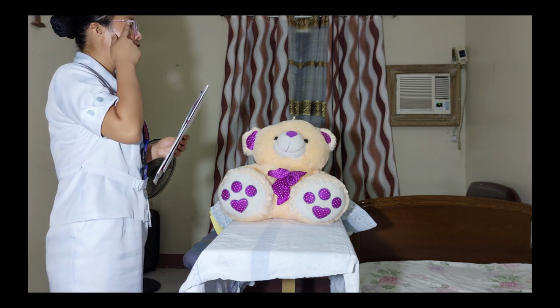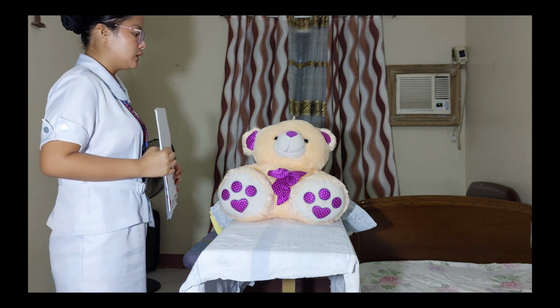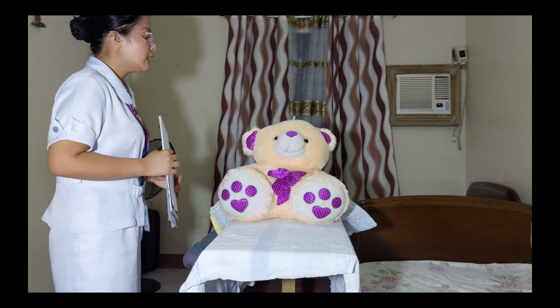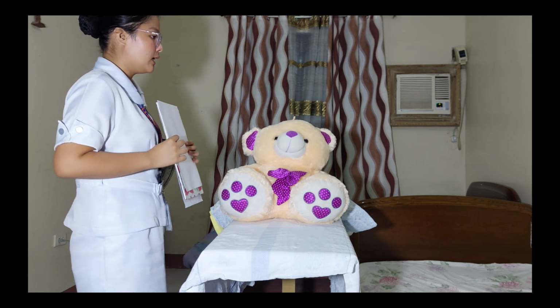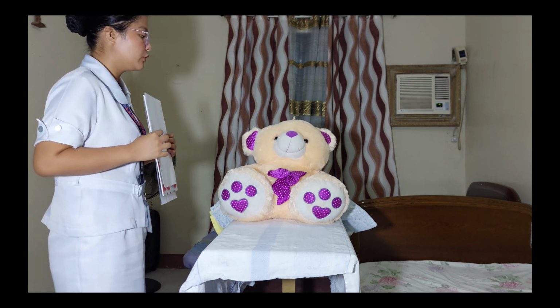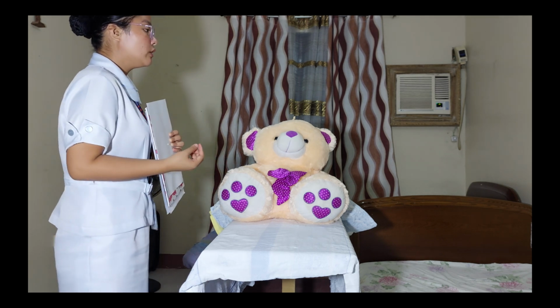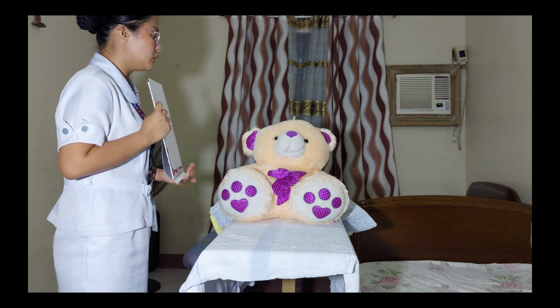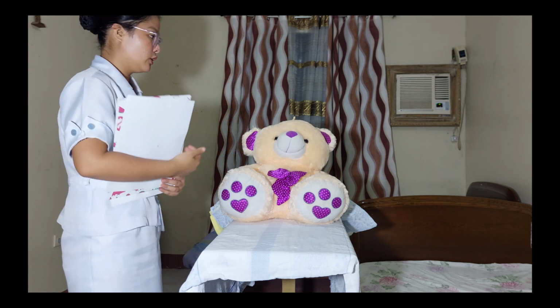So it was ordered by your physician na maglagay po ng urinary catheter sa inyo po. Ang urinary catheter po is a tube, a plastic tube na nilalagay po sa urethra natin or sa ihian po natin, to the bladder. Diretso po siya sa bladder. Ang purpose po nito is to drain the urine. Ang ginagawa po ang urinary catheter sa madaming rason.